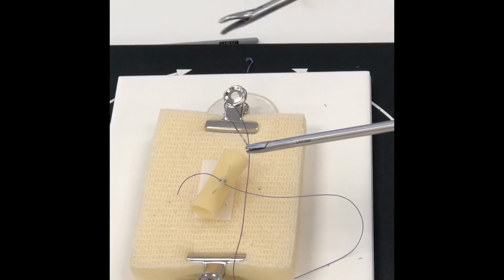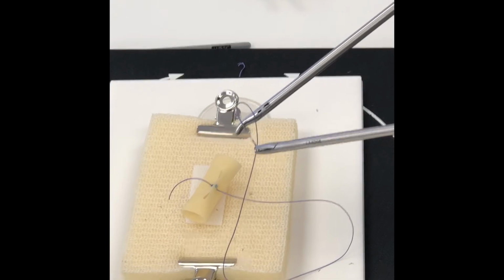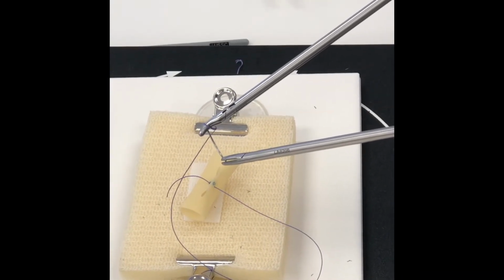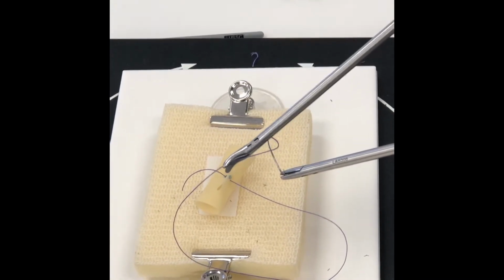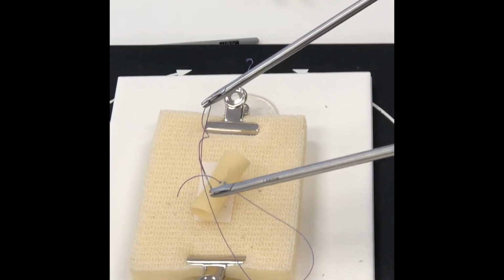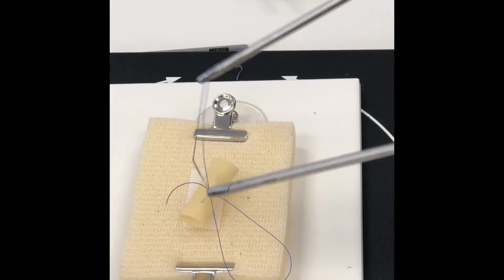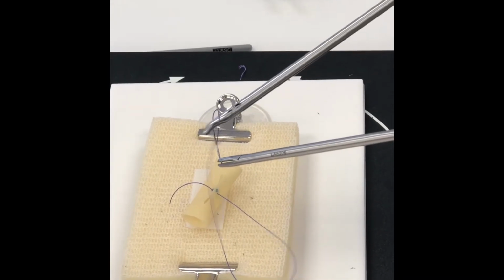If I have a curved needle driver, I'm going to put tips towards tips, and I'm going to loop around at that angle. Now this is good because I want to show you what to do if you can't get the second loop. Usually if you can't get the second loop, it's because your loop is not big enough. My loop is pretty big, but sometimes I will grab the suture and yank it to take the tension off the suture, and then I will loop again.